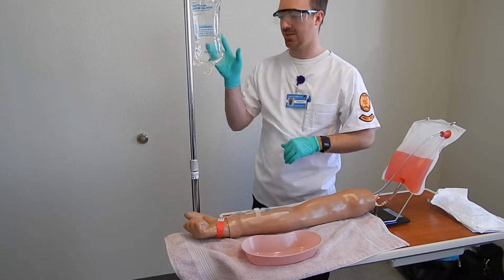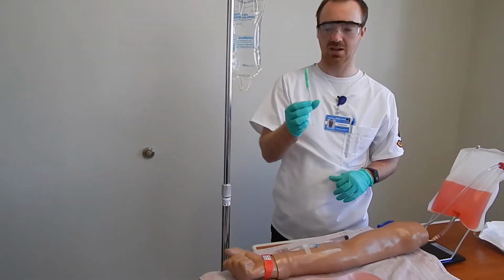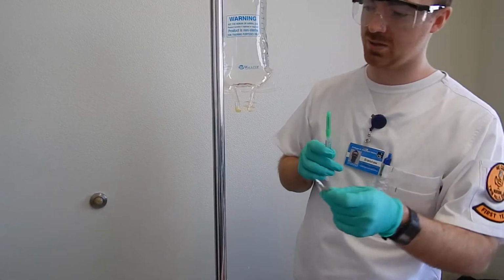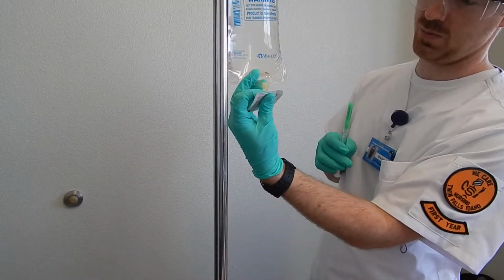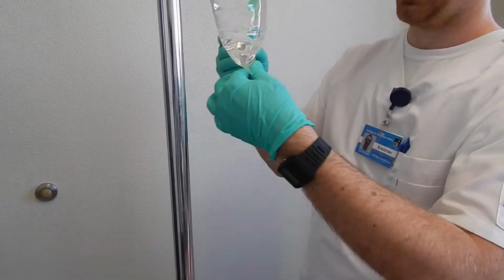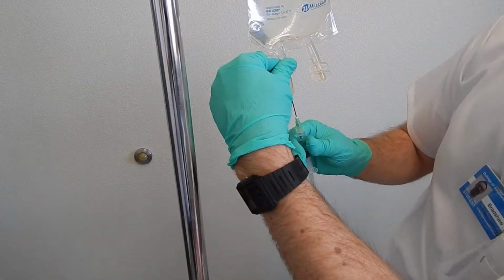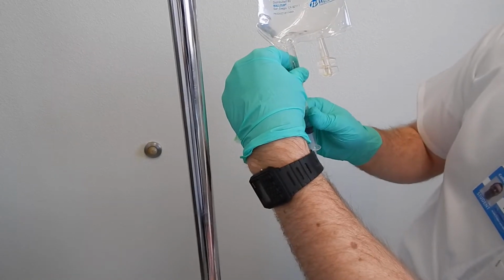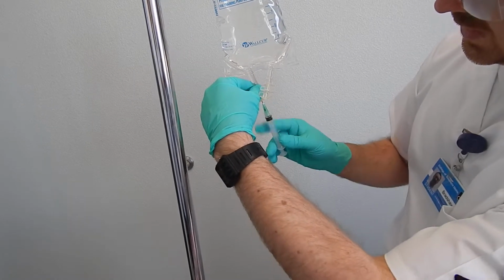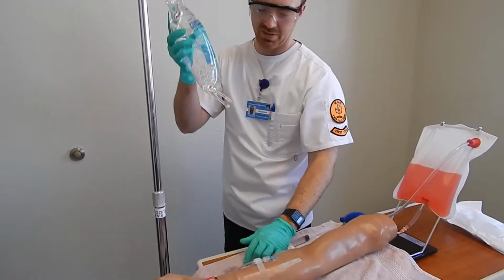So, starting out, I've got my unopened saline. I have my calculated potassium chloride. I would go ahead and take an alcohol wipe and clean off the port here for medication administration. Put that in the middle of the port. Be careful not to touch the sides. Put that in, pull out, put my safety on, and dispose of that in the sharps.